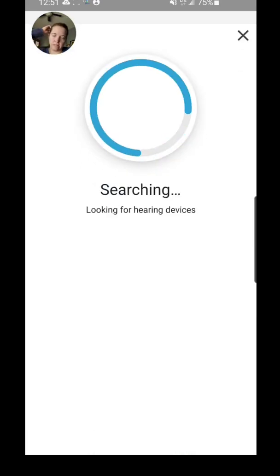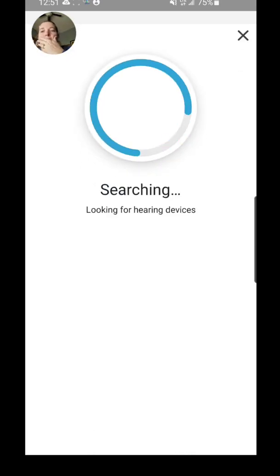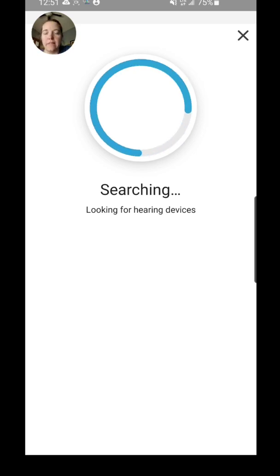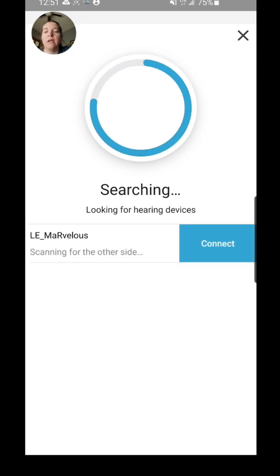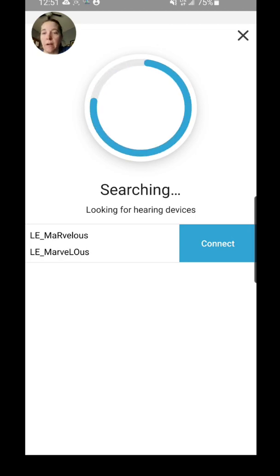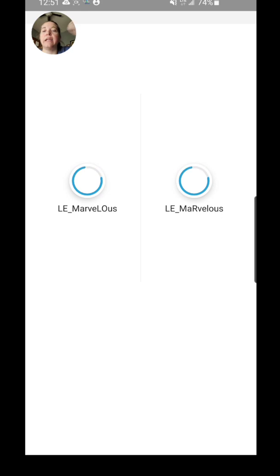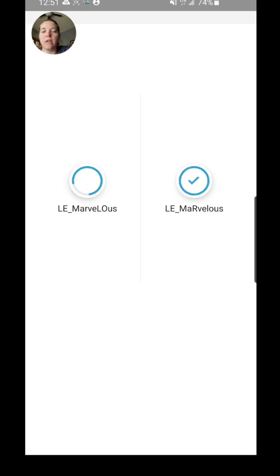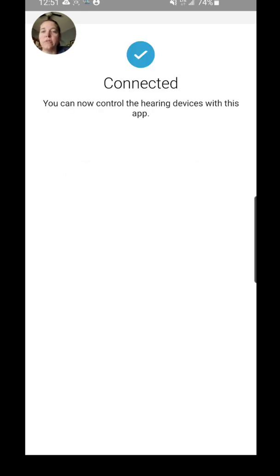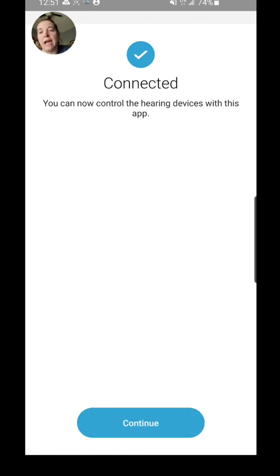So I've done that, I click on Continue, and then it's going to search for the processors. As you can see, my first one popped up, which is my right, and it's got both my right and my left now. I'm going to click Connect. You see the LE underscore—that indicates that it's a low energy Bluetooth connection, which is specific to the app.